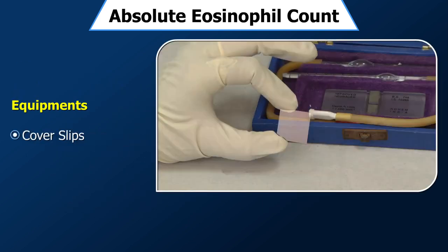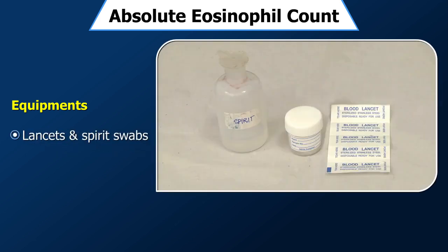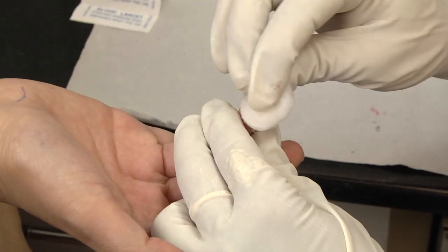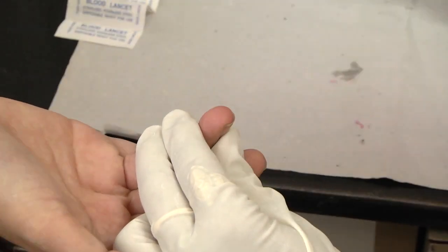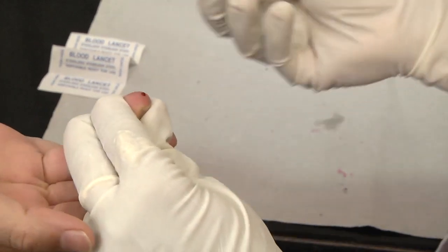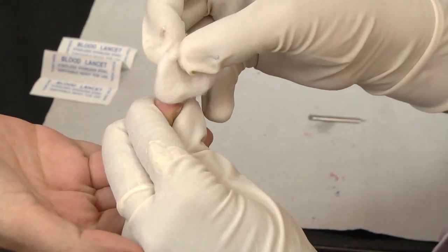Equipment: cover slips, lancets, and spirit swabs. Method: Take eosinophil diluting fluid in a tube. Wipe the finger to be pricked with a spirit swab and let the spirit dry. Then prick the finger and wipe off the first drop.